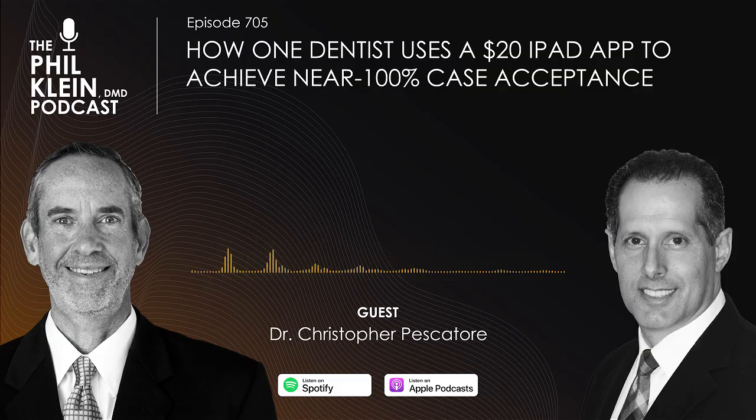When you do this, do you ever change your mind and say, hey, I don't think we can go this way? Every time I do a case, I say, oh, there's something here I might have missed, or, oh, look at this. And one of the great things about doing it this way, over my 35 plus years of bonding porcelain to teeth, is you know that certain areas of certain teeth require a little different preparation for functional reasons. So I built that into the library, but I also built that into how I digitally prep the simulation, because I know these certain areas need to be covered with porcelain versus I know this is a possible interference. So I can automatically do that.